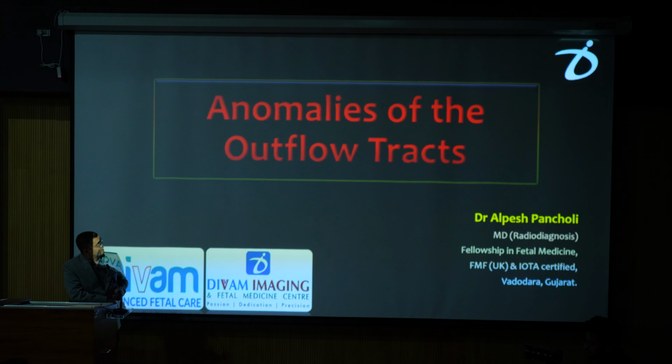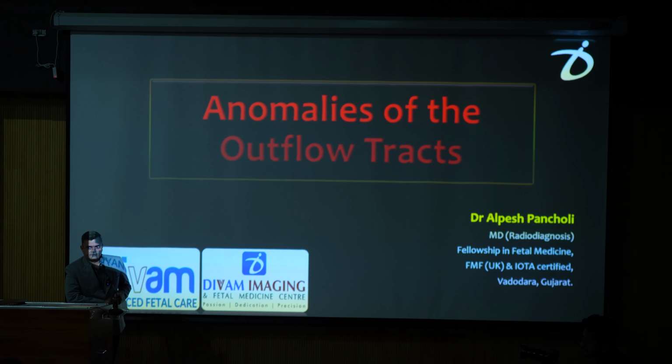And so we have discussed four chamber views, in which we have discussed left ventricular lesions and right ventricular lesions. Now we will go one step ahead, that is the great arteries.